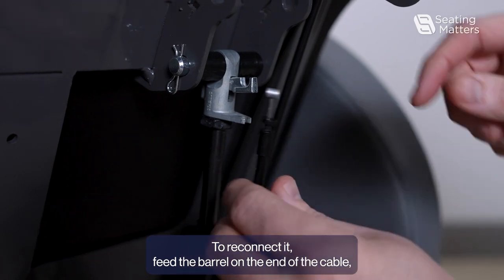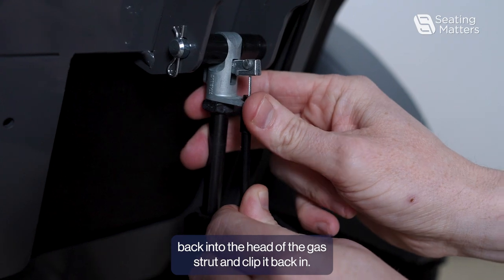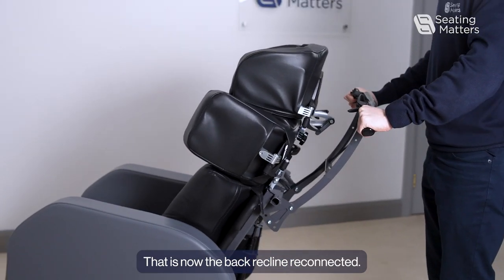To reconnect it, feed the barrel on the end of the cable back into the head of the gas strut and clip it back in. That is now the back recline reconnected.